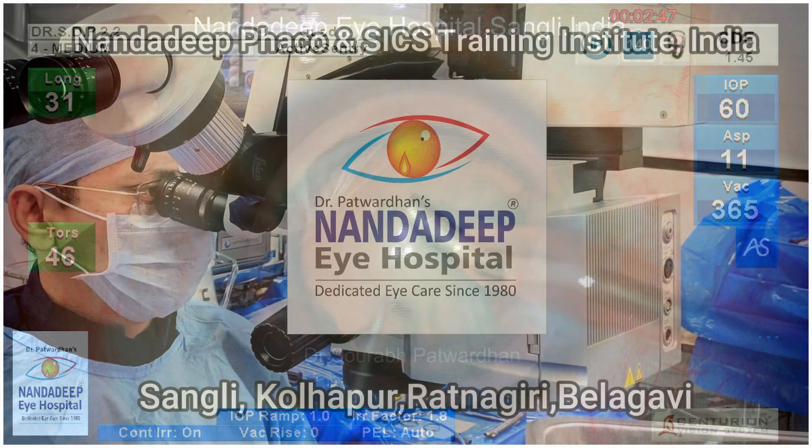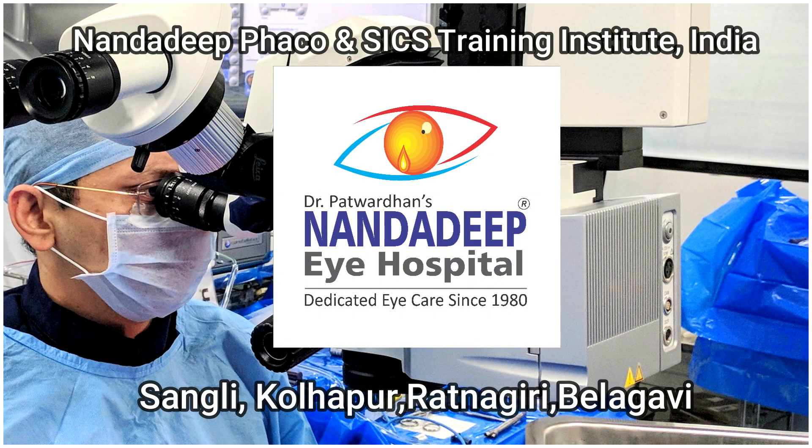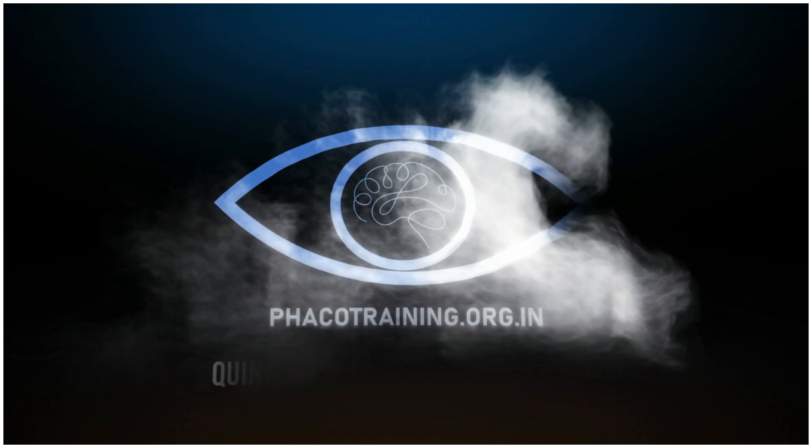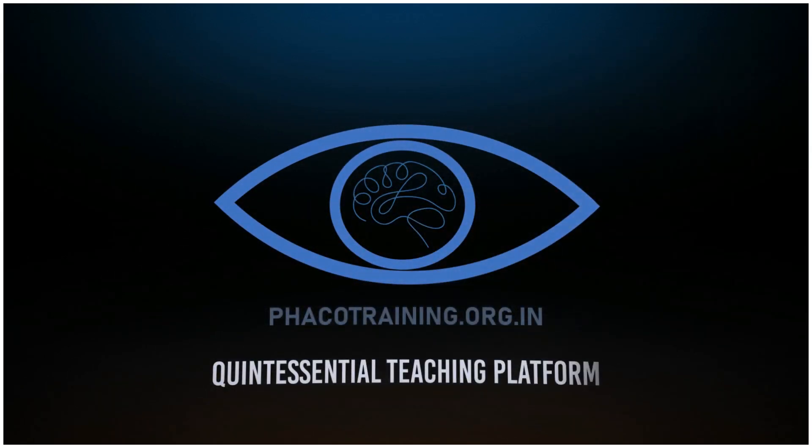You can see I could lift the nucleus up from the edge using just vacuum. If required, we can use a little bit of longitudinal power, and after that it is very easy to emulsify. When you see a similar case next time, do try this technique and you can comment about it. Thank you.